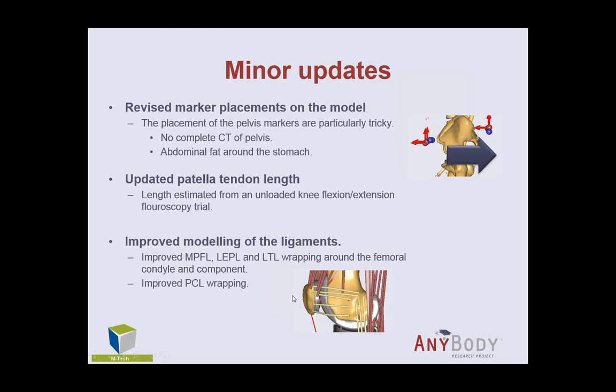And then last but not least, we tried to improve the modeling of the ligaments. Especially we put in more wrapping surfaces, so the wrapping around the femoral condyle and the component for the ligaments that have to do with the patella. And also we improved the wrapping of the PCL around the component.